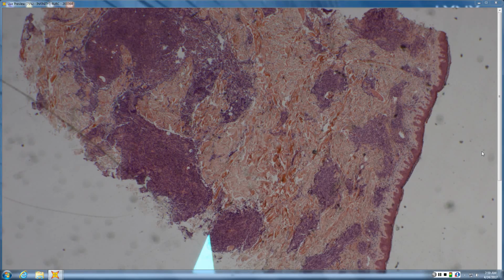So something that's vertically oriented in the center, pretty heavy, pretty dense. I certainly don't see follicular hyperplasia or epidermal hyperplasia suggesting a reactive infiltrate. So I'm thinking probably lymphoma, but it's vertically oriented, middle of the dermis. So I'm thinking probably marginal.